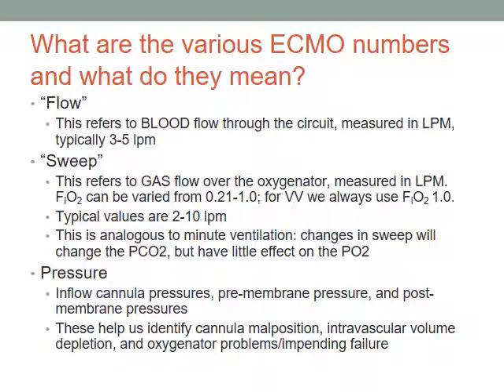There are different kinds of pumps. We use exclusively something called centrifugal pumps. Those are little whirly pumps that we see. There are also, in some mostly pediatric centers still, and historically, what are called roller head pumps. These were great big pumps where the tubing was squeezed by a roller. You have roller pump technology in some of your IV pumps, but these were great big pumps that squeezed the great big tubing and pushed the blood along that way.